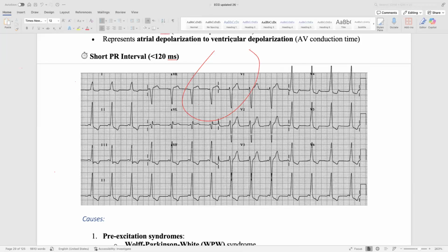The heart is this way. There is left bundle branch block because of left ventricular ischemia. This bundle is supplied by the blood. If there is ischemia, it will not be supplied anymore.